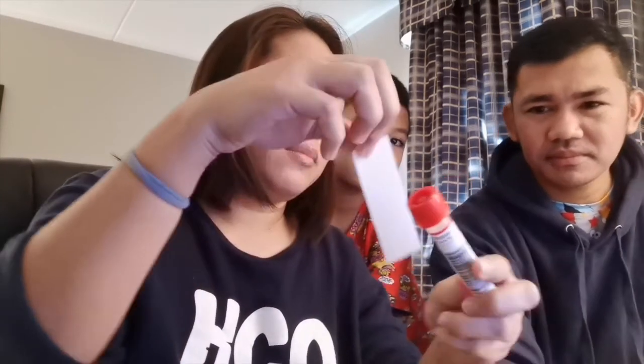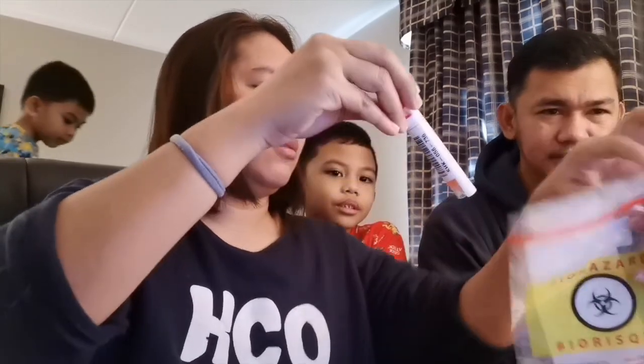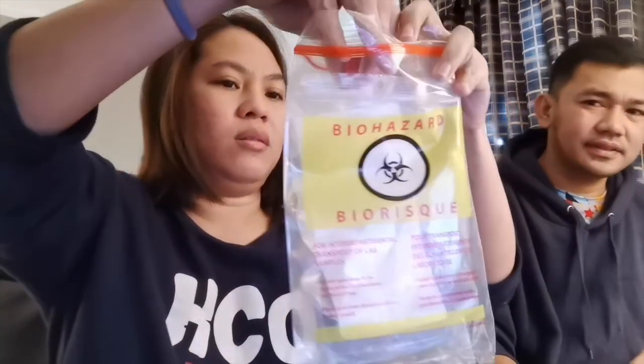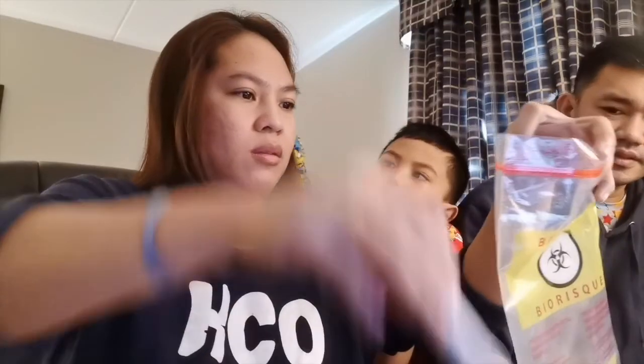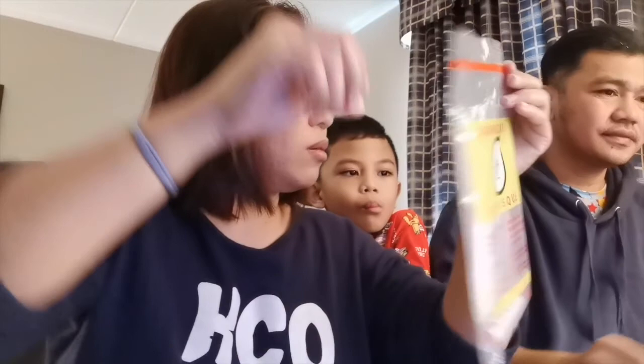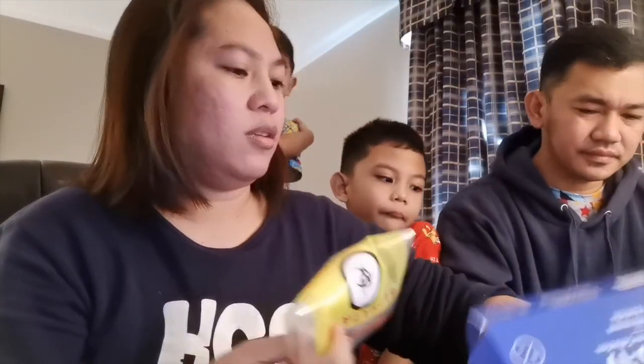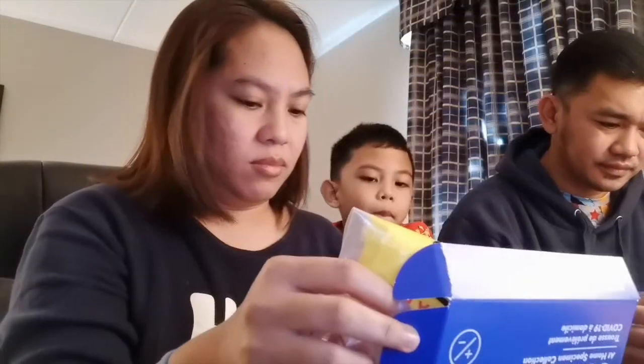Okay. Here you go. Don't cover the serial number. The horizontal, okay, perfect. Now we'll put it in the bag. Then we will put that back in the box where it came in, the blue box. This one? Yeah, exactly.